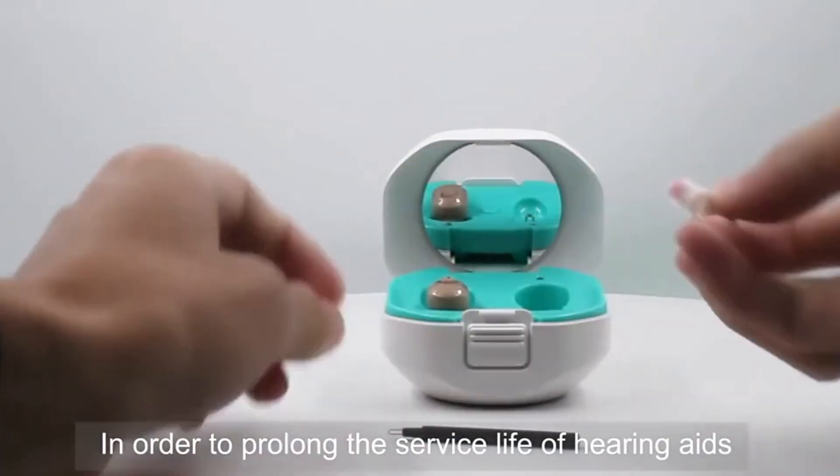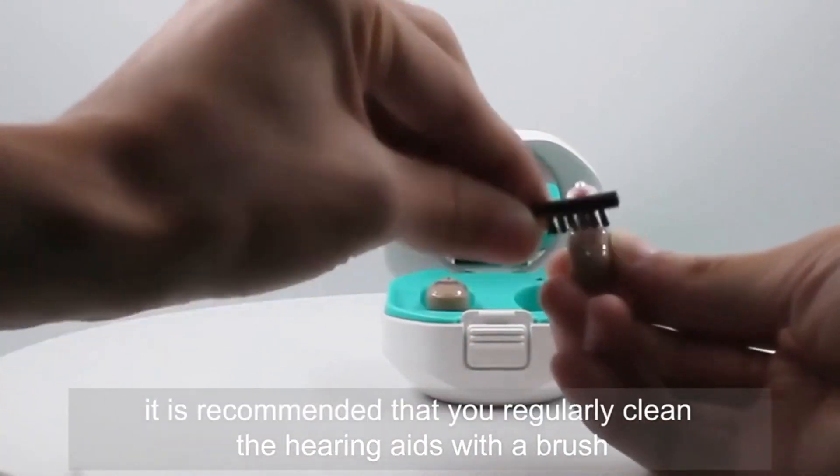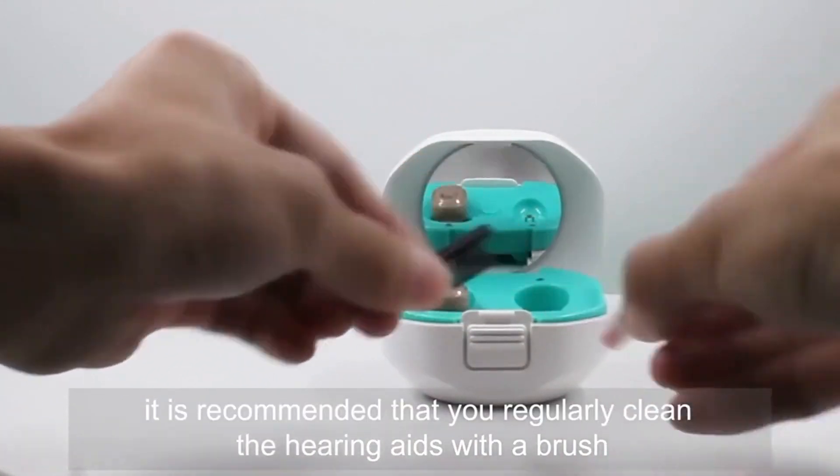In order to prolong the service life of hearing aids, it is recommended that you regularly clean the hearing aids with a brush.